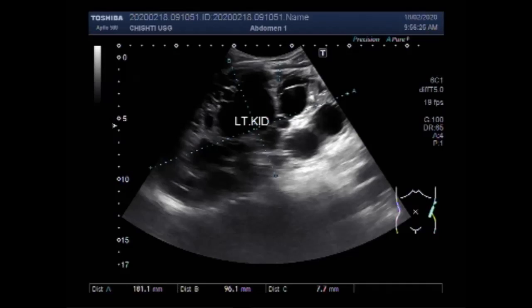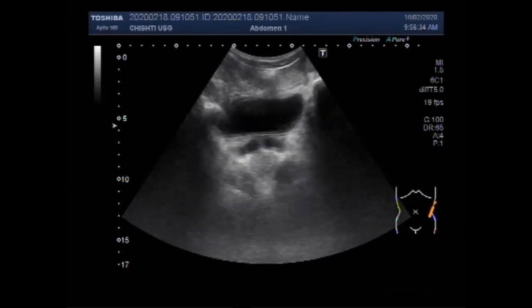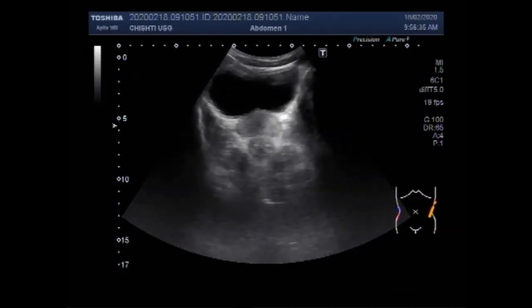Now you can see the left kidney. It is also enlarged in size and it measures 18.1 x 9.6 cm with decreased cortical thickness.